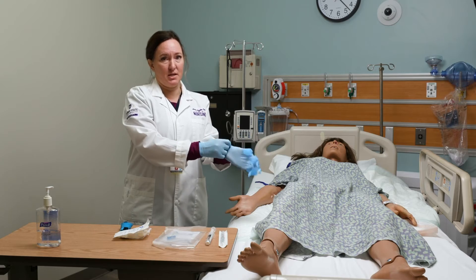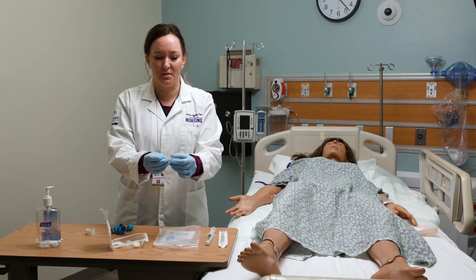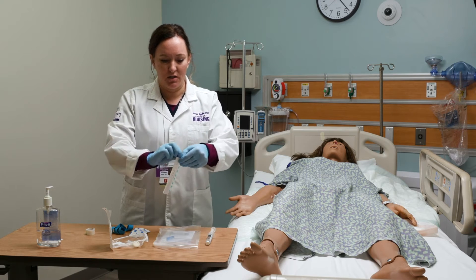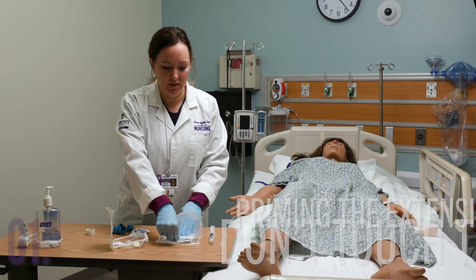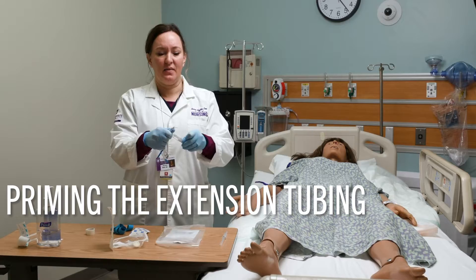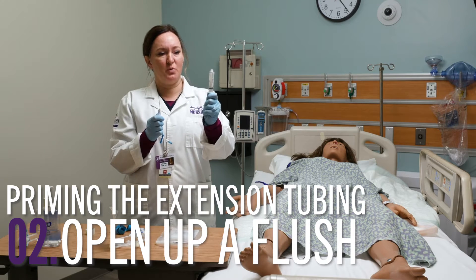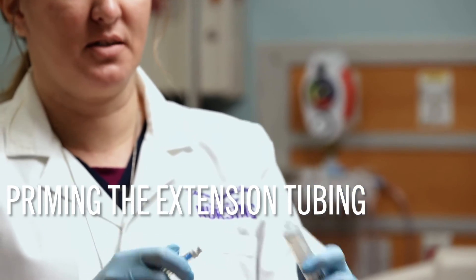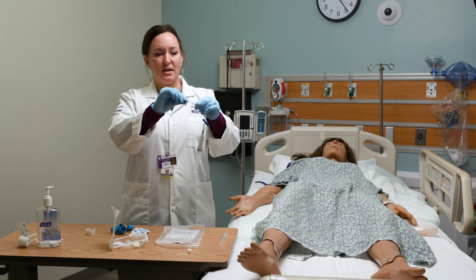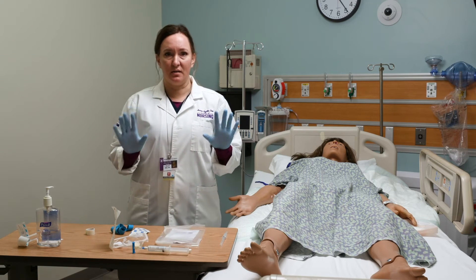You'll want to set up your supplies. I like to set the tape aside. I don't use the gauze so I'll set that aside too. As far as the Tegaderm goes, if you just bend down the plastic backing a little bit it gives a good lip for you to grab. You can open up your needle and make sure it's ready to go, and then the last thing is to prime the extension tubing. When you get the extension tubing out of the package, make sure you don't touch the clave — keep that as sterile as possible. Open up a flush and keep that end sterile as well. If it's a brand new flush, just pull back a little bit to break the seal and then push the air out. Attach the flush to the clave and prime your extension tubing. At this point I like to take off the cap because I don't want to mess with it later, and I'll set it inside the package so I can guarantee it stays clean.